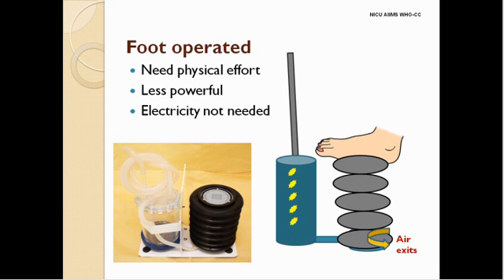Few important considerations while using the suction machine include that the right foot has to be placed on the bellows, which have to be pressed down, ensuring that they come in direct contact with the central vertical metal plate. The foot pressure can be adjusted to ensure adequate suction. Some foot suction machines also have a manometer attached so that the pressure can be regulated.